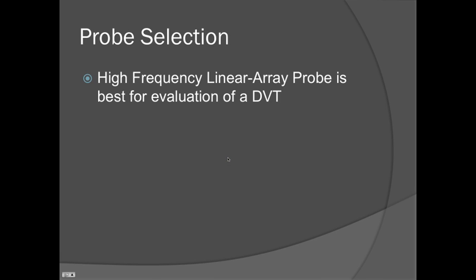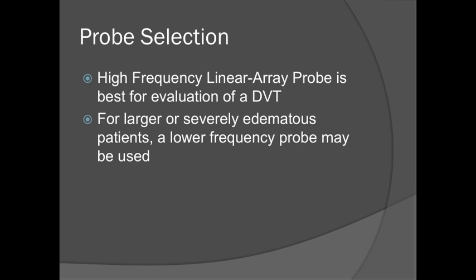I sort of gave it away before, but we're going to use the high frequency linear array probe because that's the best for evaluating a DVT. It gives you a nice crisp, clear image that has better resolution with the higher frequency probe.